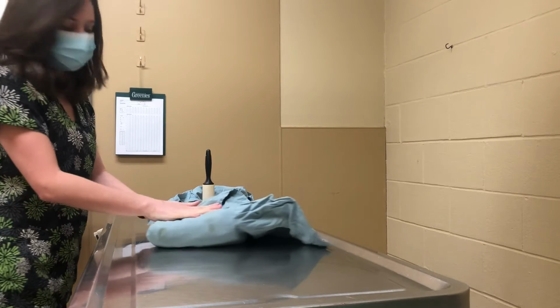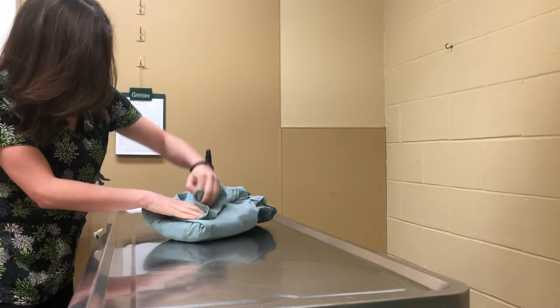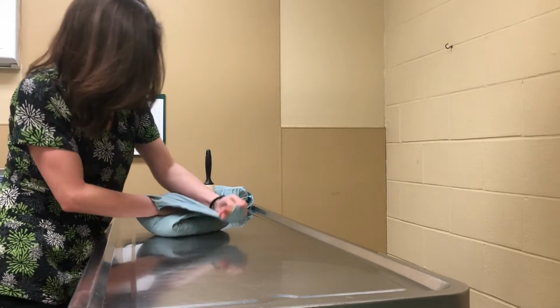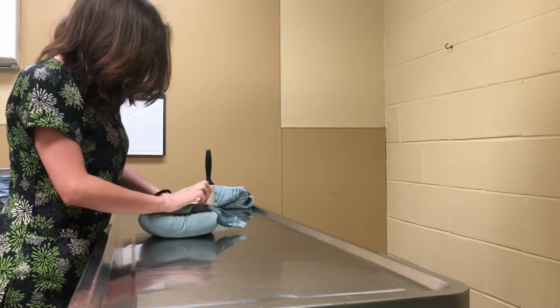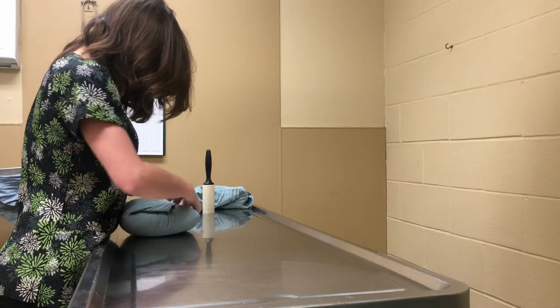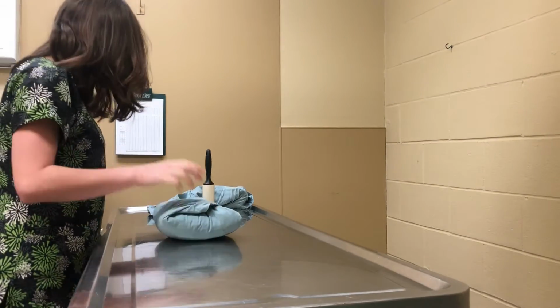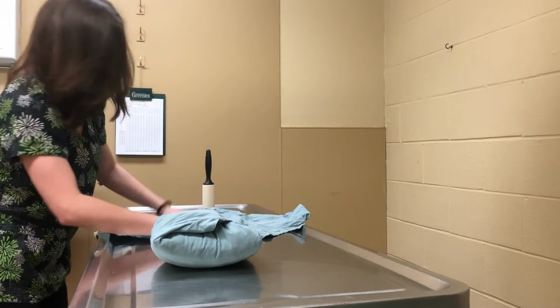And then I'll repeat this for the outer gown. And then I'm going to tuck this last one in so that a little triangle will appear like that. And do the same thing with the straight.